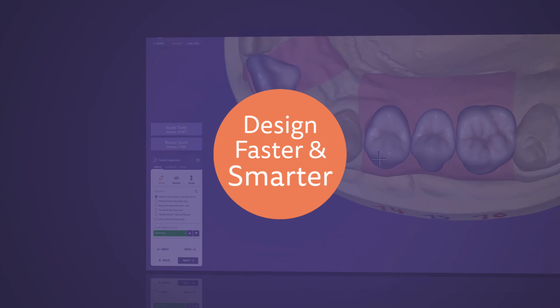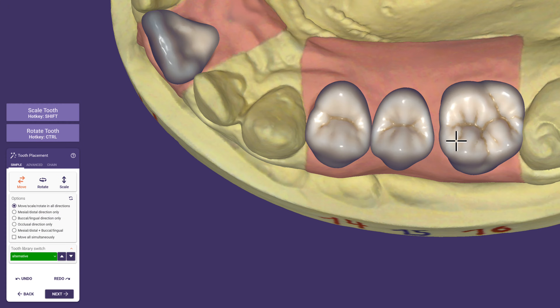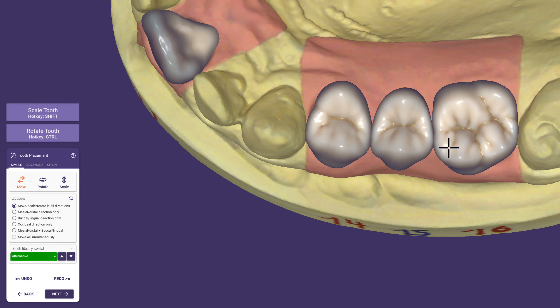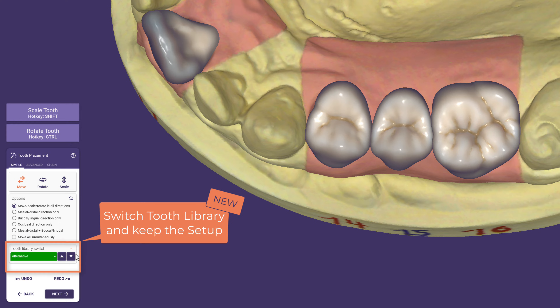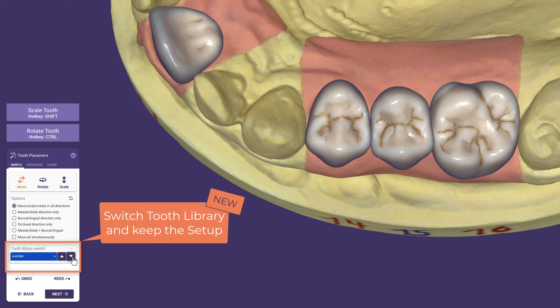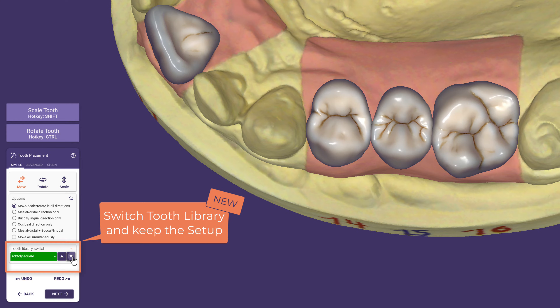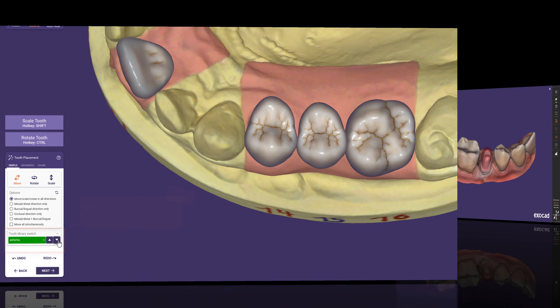Do you like to switch tooth libraries while keeping your previous setup? With this release, it is now possible to toggle and select your desired morphology while keeping the previous setup. Feel free to cycle through different libraries even after you have already invested time into the setup.